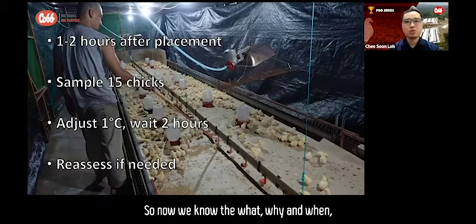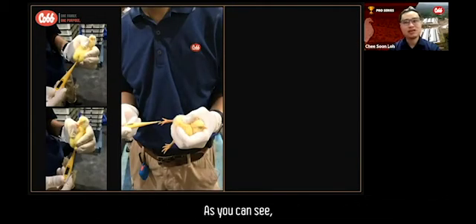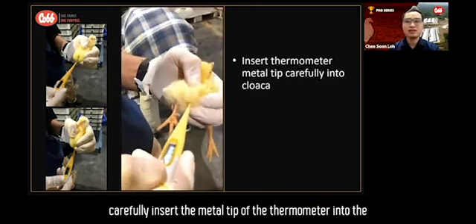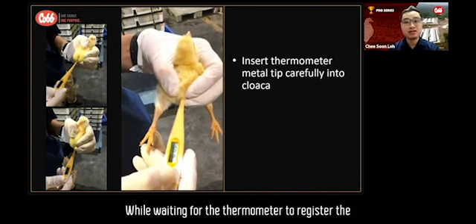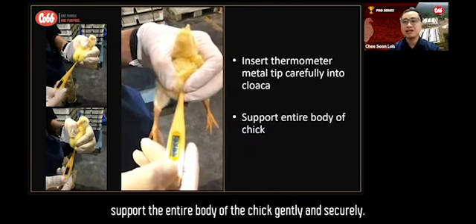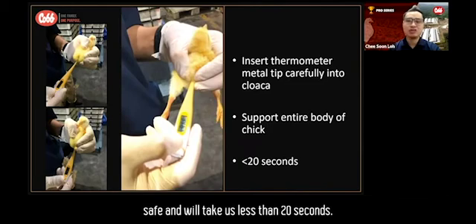So now we know the what, why, and when. Let's have a look at the video of how we take chick rectal temperature. As you can see, using a normal quick-reading digital thermometer, carefully insert the metal tip of the thermometer into the chick's cloaca. While waiting for the thermometer to register the temperature and beep, support the entire body of the chick gently and securely. This process is simple, safe, and will take less than 20 seconds.